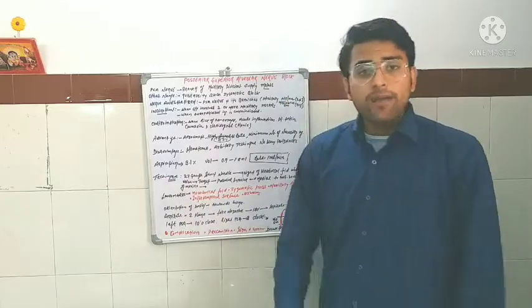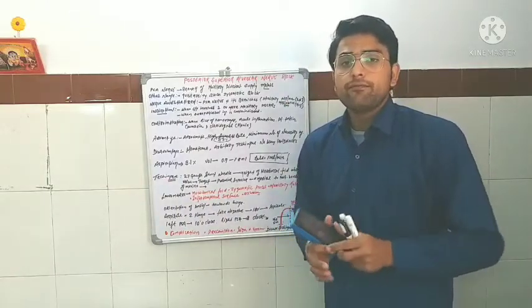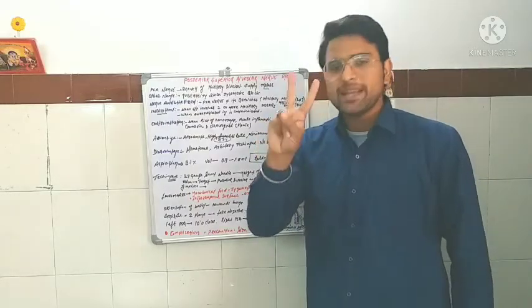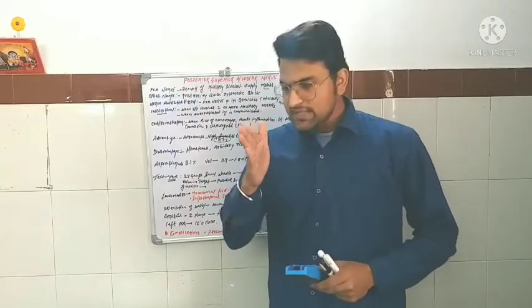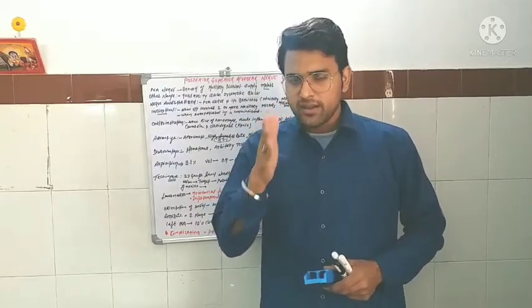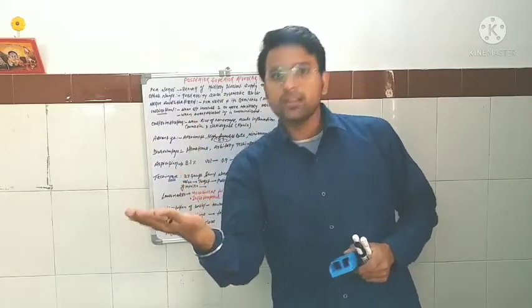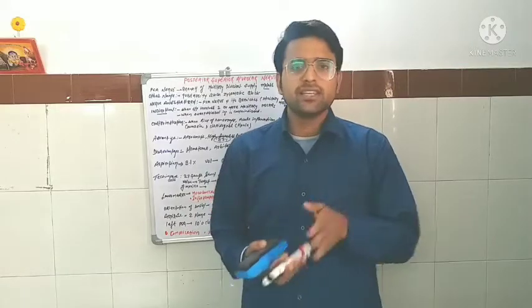Aspiration. Why do we do the aspiration? Aspiration is very important to check if we are contacting a vessel. Two-plane aspiration is done. Why do we do two-plane aspiration? First, after inserting the needle, we aspirate, then completely rotate the needle 180 degrees and then aspirate again, because if the vessel wall is against the needle, a false negative aspiration can occur.